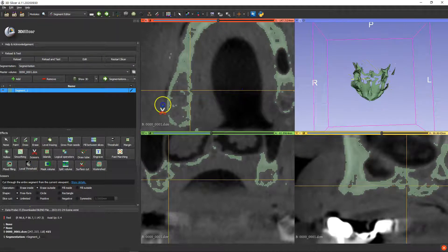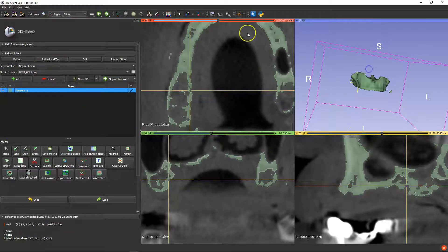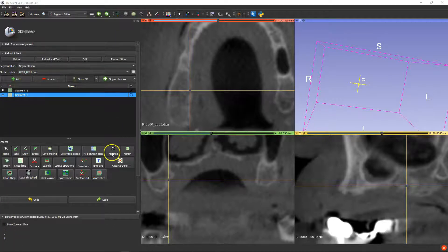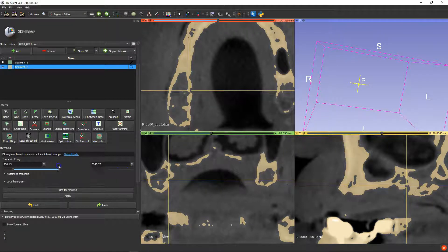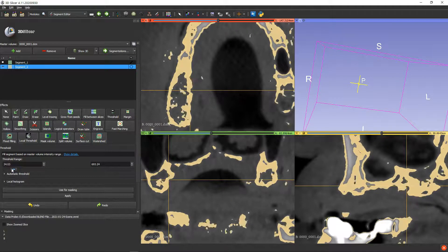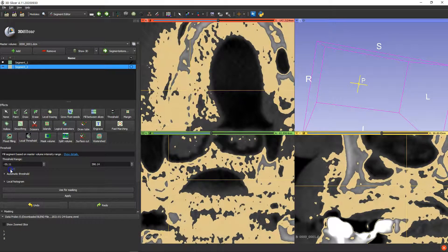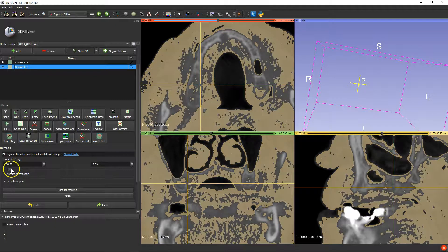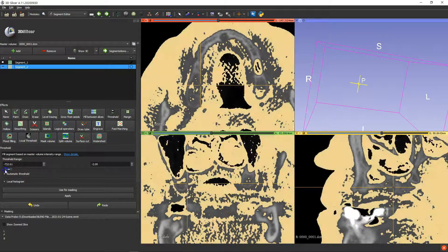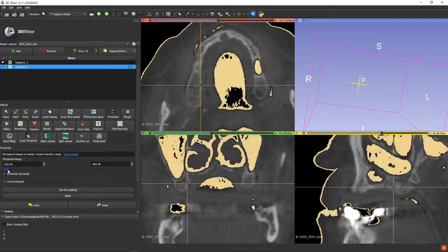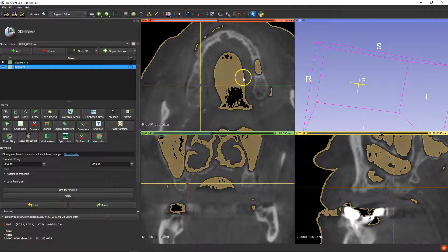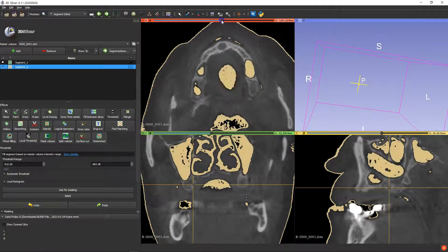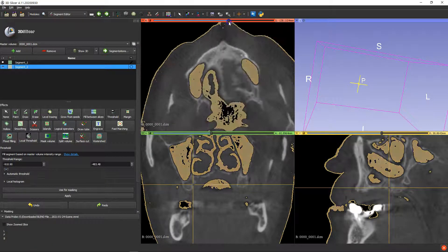After that we're going to segment the sinus cavities. I'm going to hide that one, add a new segment, and set a threshold value. This time around we're going to go the other way to highlight the black. That's what I want to see — this would be the tongue, I suppose. We can get to see the sinus area.